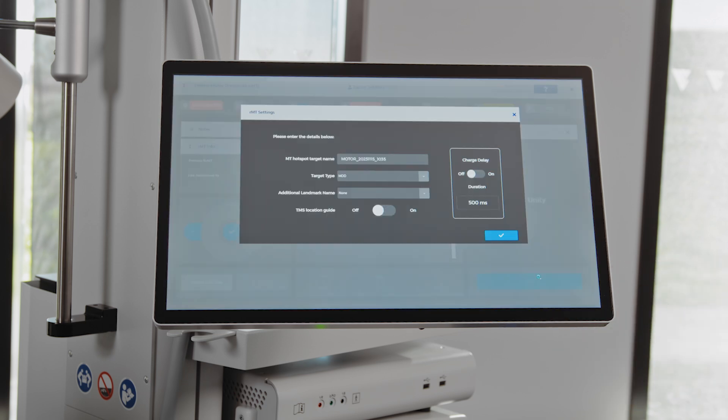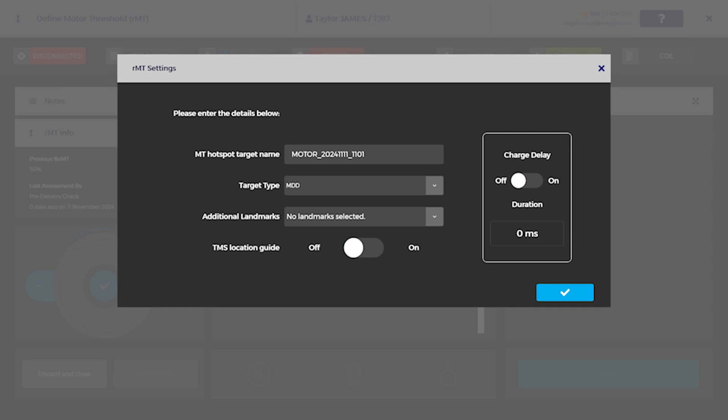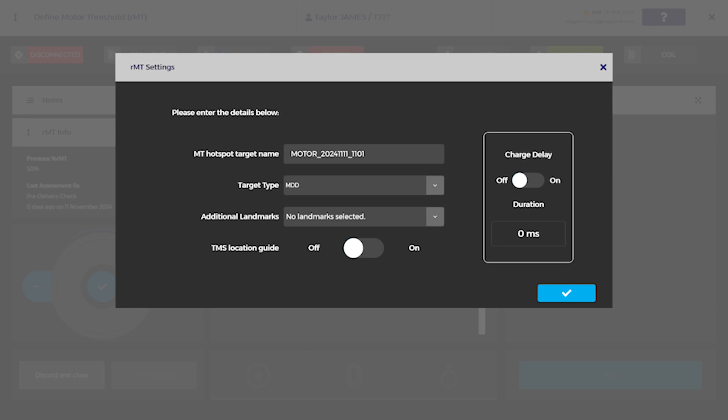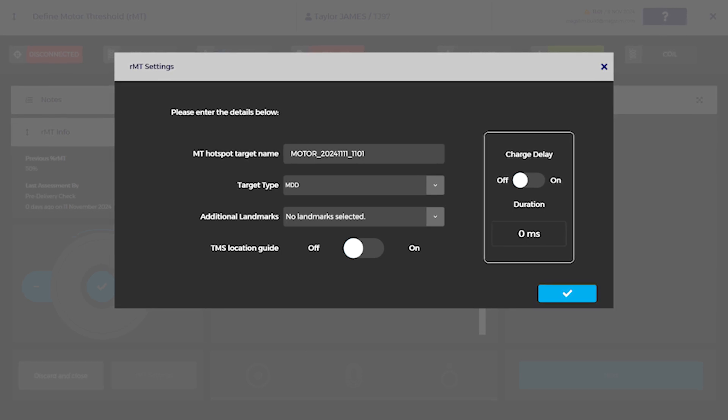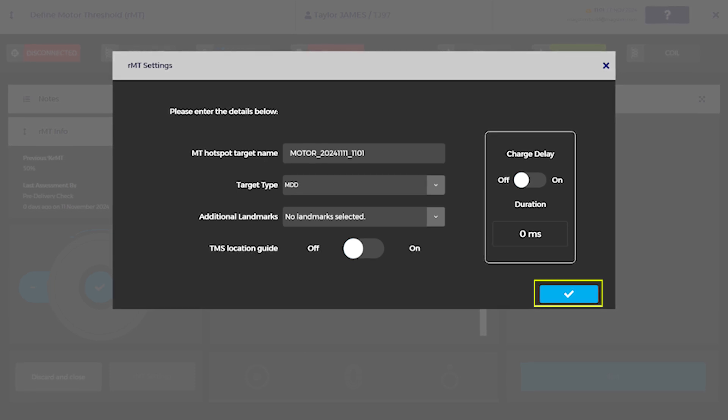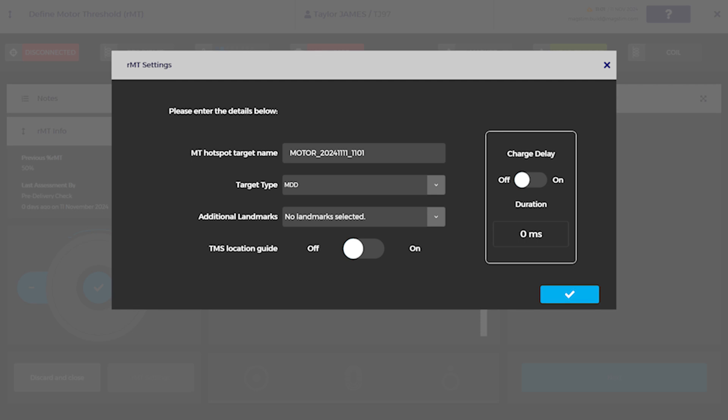In RMT settings, the following are configurable: MT Hotspot Target Name, Target Type, Additional Landmark Name, TMS Location Guide, Charge Delay and Duration. Once all fields have been confirmed, select the blue check icon to move to the Define MT Hotspot screen.